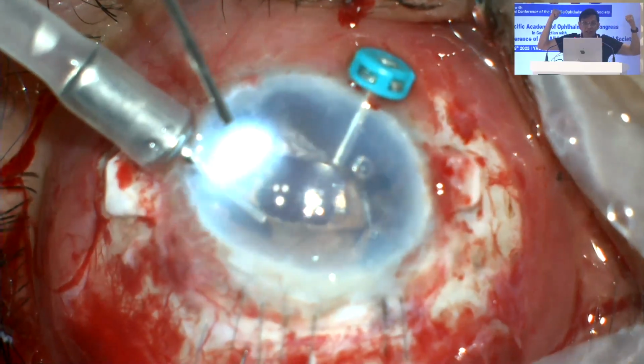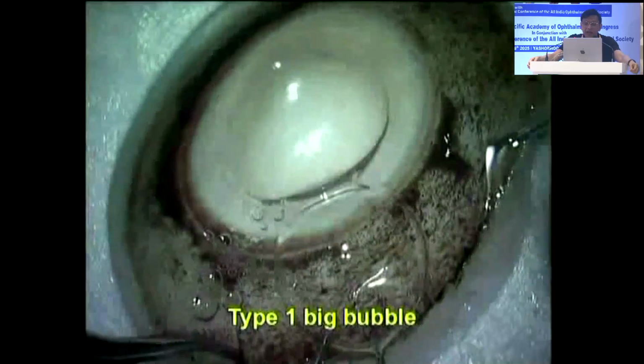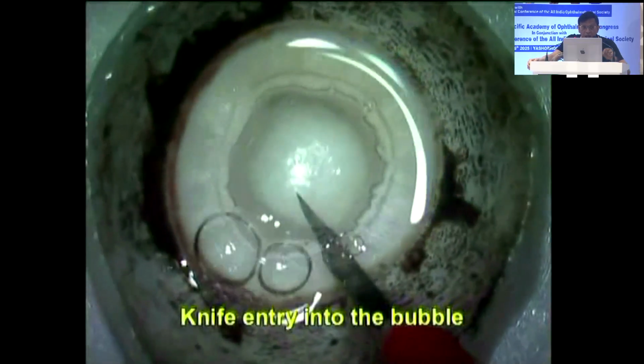Remember, when you pull like this, the two double arms, it will repair the iris. So the iridodialysis can get repaired. Now remember, the cornea is bad. Descemet's endothelium gone. So now I do the PDEK.